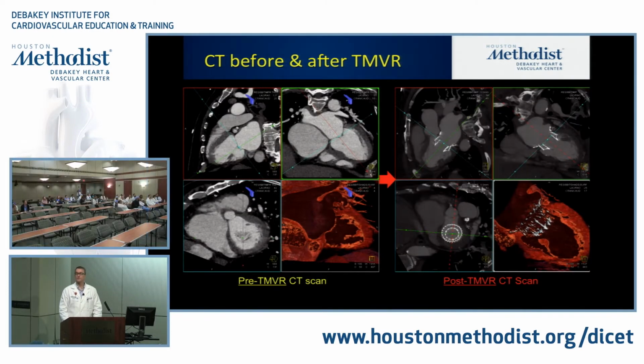Absolutely. That's one of the technology challenges: how long do you anticoagulate for? You do anticoagulate, but you want some controlled coagulation to fill that in. Most of the devices have something like that. There's some way to insulate all that annular motion from the device so that it keeps working properly.